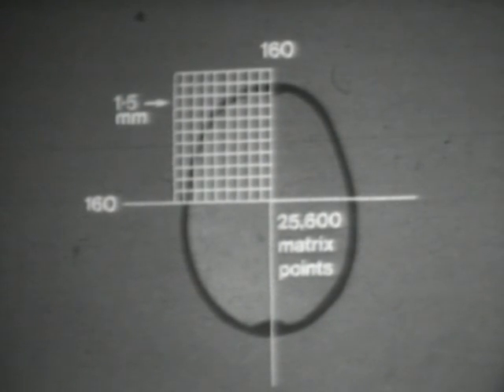The computer registers 43,000 readings of X-ray photon transmission, and it is from these readings that a sufficient number of simultaneous equations can be constructed to enable the computer to calculate the necessary 25,600 absorption values for the matrix of 160 by 160 cells. The absorption values are used as picture points in a cathode ray tube intensity display based on the relative densities of different tissue structures.